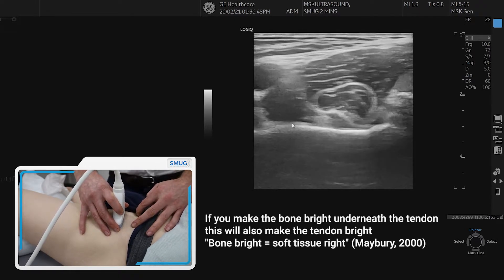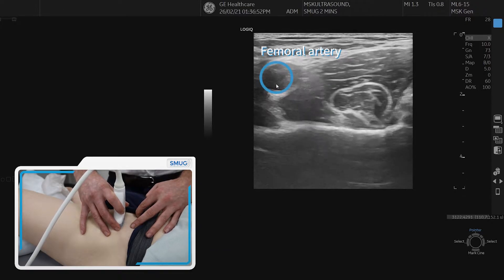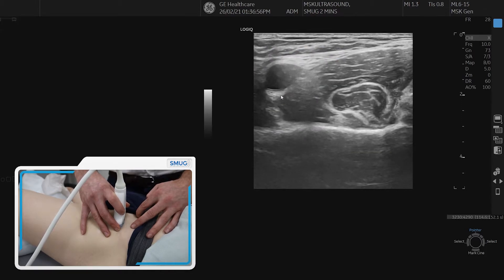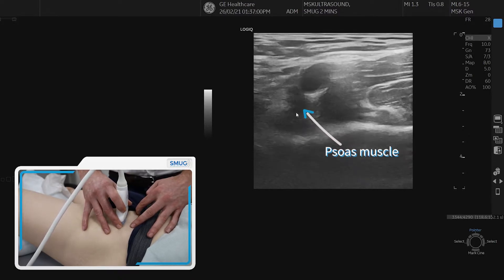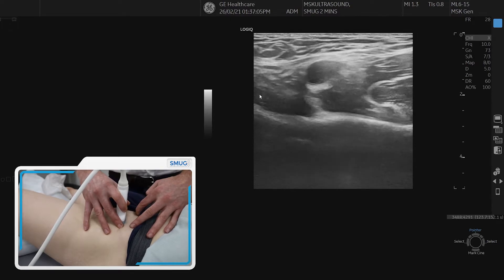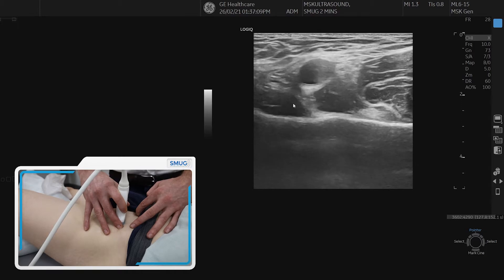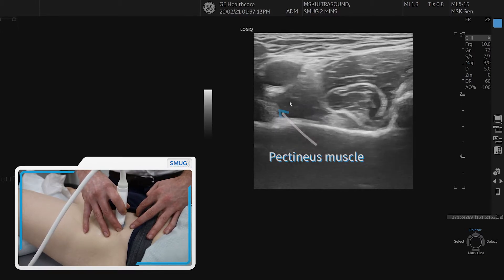Now, if we move medially, we see a nice landmark, which is the femoral artery pumping away there. And that's a nice landmark because underneath that is the psoas muscle belly. If we move more medially, we can also see the hyperechoic line of the pelvis, but on top of that is the pectineus muscle. So it's important to orientate ourselves in a transverse section.